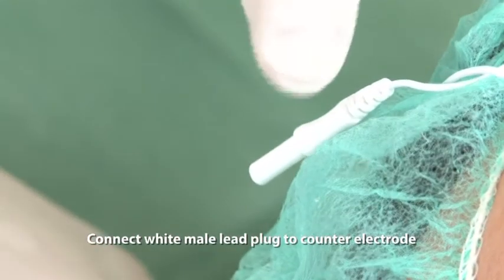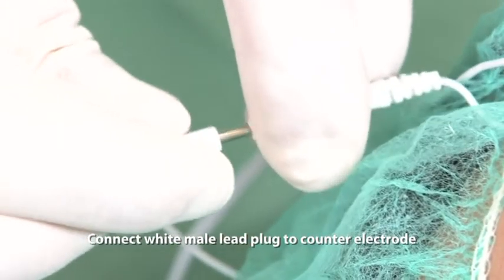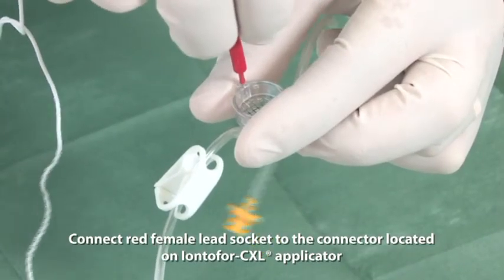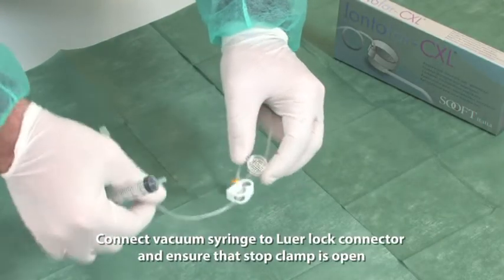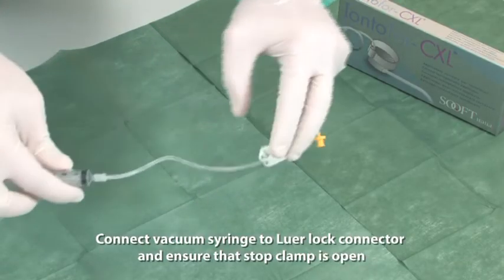Connect the white male lead plug to the counter electrode. Connect the red female lead socket to the connector located on the Iontophoresis CXL applicator. Connect the vacuum syringe to the lower lock connector and ensure that the stop clamp is open.